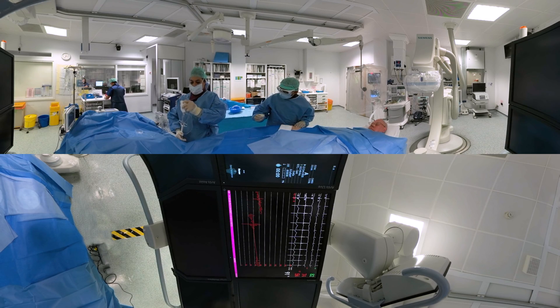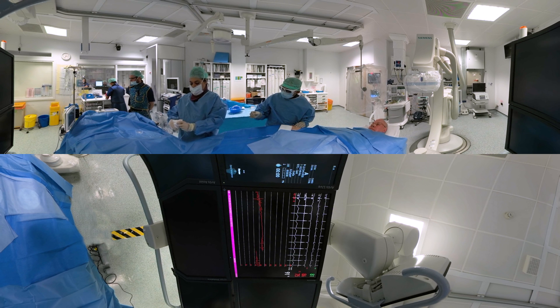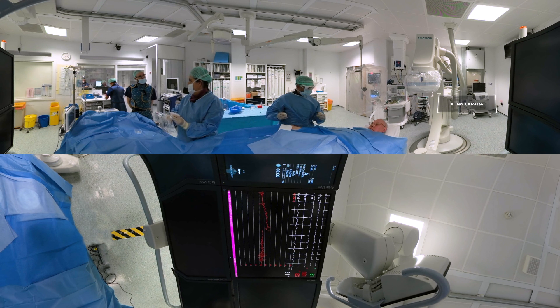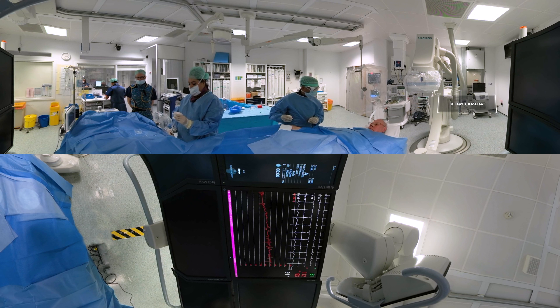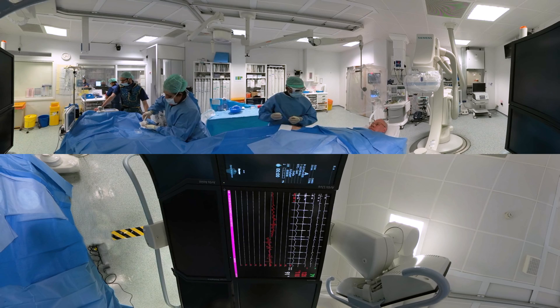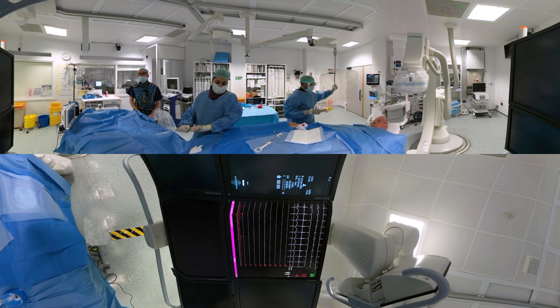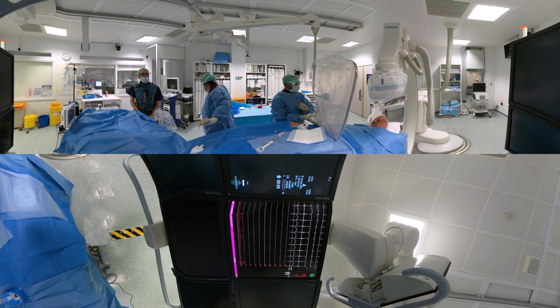At the end of the table is our radiographer, who is responsible for moving this camera around so we can get pictures of the heart from different angles. That allows us to best see the narrowings and what's going on to cause the problem. We use contrast or dye — that's what we inject into the artery to get the pictures. We're now going to get the x-ray tube in; this is the camera that takes the pictures.